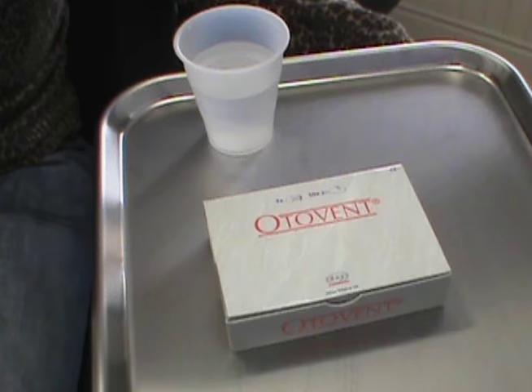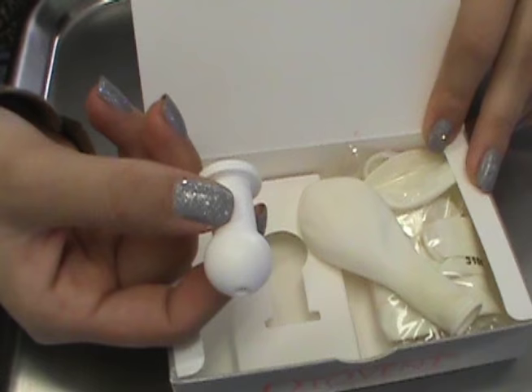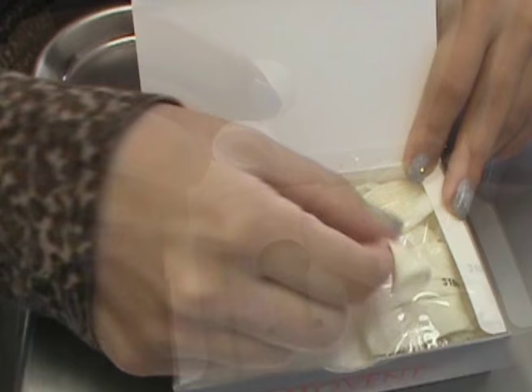This is the Otovent kit. It's a very simple little device but it's brilliant. How it works is you simply have to get air into your nose while you're swallowing at the same time. This is the Otovent kit and a glass of water are all you need to do this procedure. The Otovent kit should be provided to you by your doctor. Inside you will find two basic items: a white plastic device with a round end for your nose and a flat end for the balloons, and then there's a bunch of balloons which you can reuse. Our assistant will put these two items together to get things started.